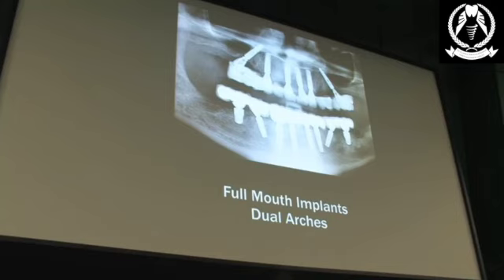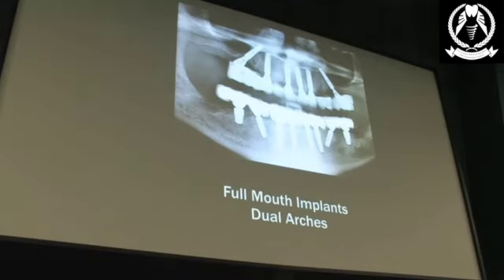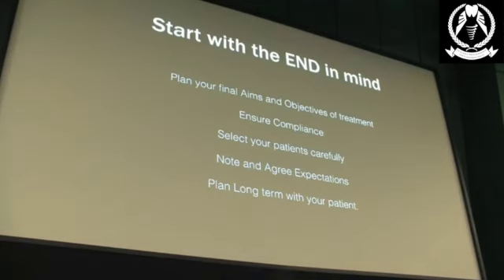J, and we just went medially to the sinus wall, and we angled the last 2 implants, which is a perfectly acceptable technique to not further put him under trauma of doing bilateral sinus lifts in this case. So it's conservative. So the main thing to take away from my message is really start with the end in mind with all your cases.